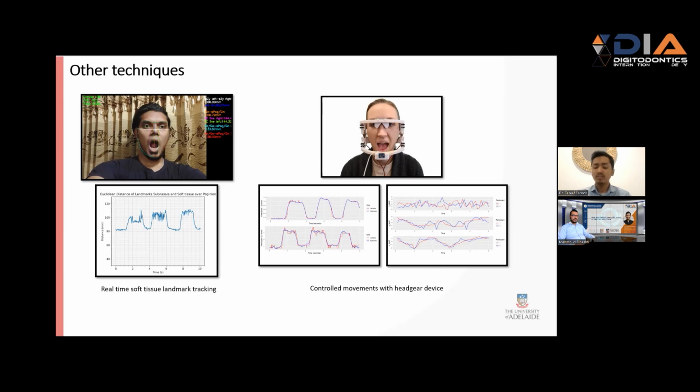When we put all of this together while evaluating whether there is a joint component, a jaw component, or a muscle component, it helps us plan our dental treatment better, especially for orthodontics, prosthetic rehabilitation, and more importantly for implants, which are more prone to fail if there is an undue occlusal force that might not be because of the occlusion itself, but might be because of the TMJ complex.